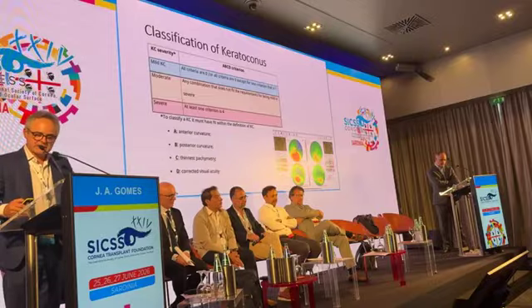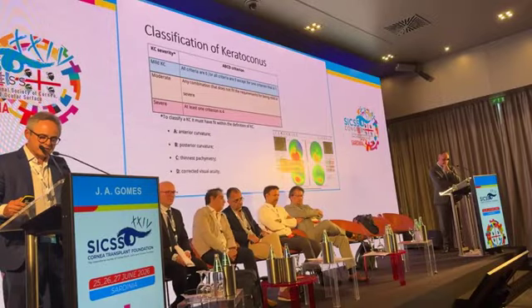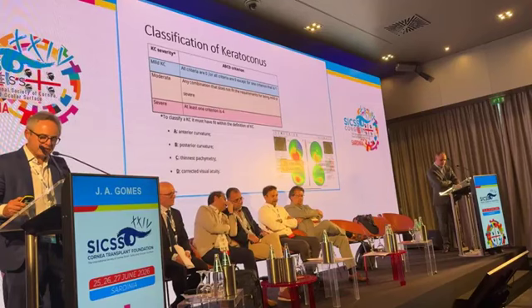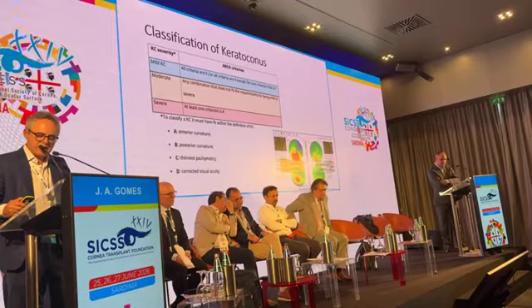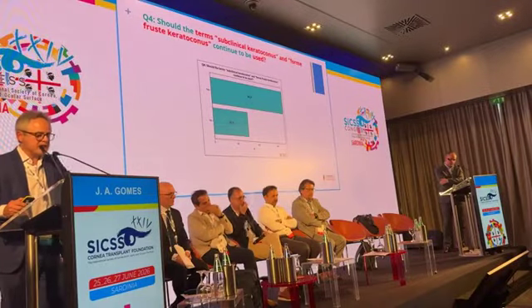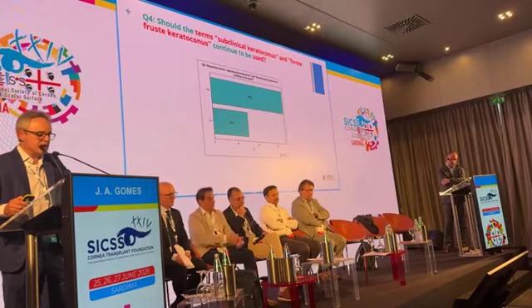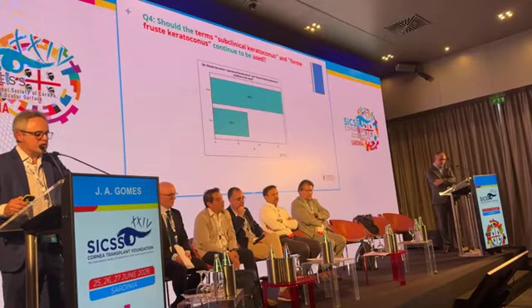As you can see here in these Scheimpflug maps, there is a keratoconus that was graded with the Belin as A1, B1, C1, D1. This is considered a moderate keratoconus. In the other eye, just one grading is C1, the others are 0, which is a mild keratoconus. And this was accepted as a nice simplification of the ABCD Belin classification.